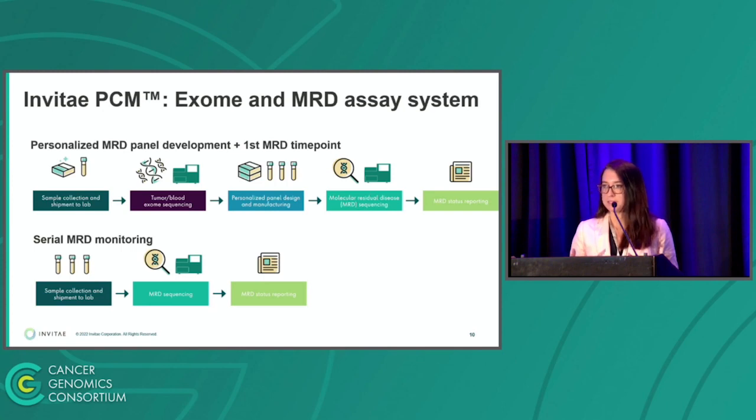And that's going to follow that patient over time. If they were to have a test today before they have treatment, and then they're going to have it again, say, in 6 months or a year, it's the same panel that's going to be leveraged for that patient. So then we take the cell-free DNA and apply that panel to it and get an MRD call. And so that's a positive or negative call or a percentage, and that comes out as a report. So that last step can be repeated over and over again.